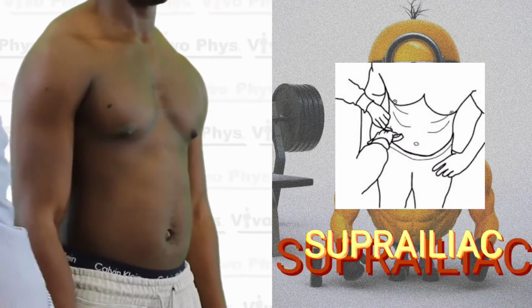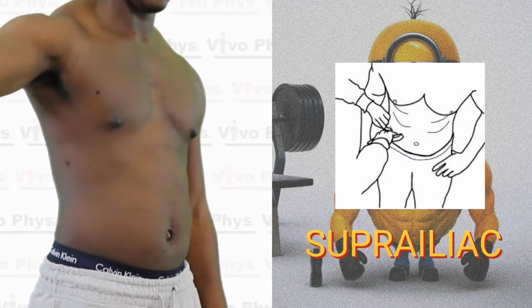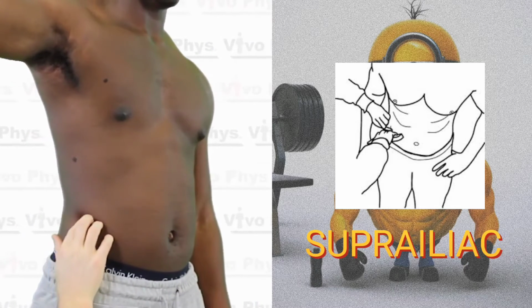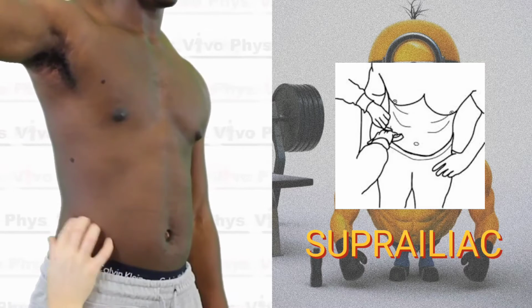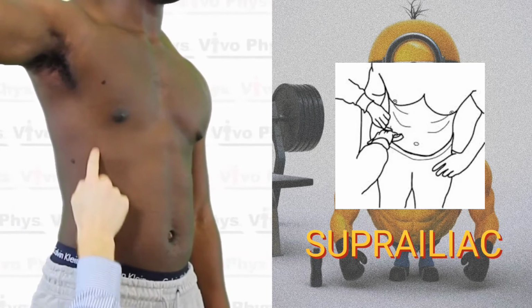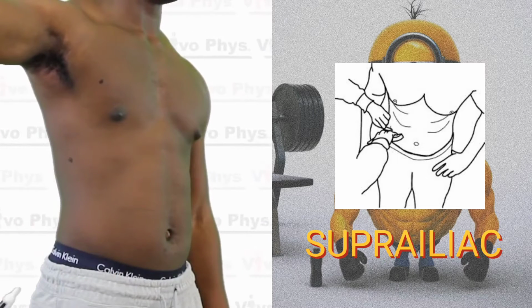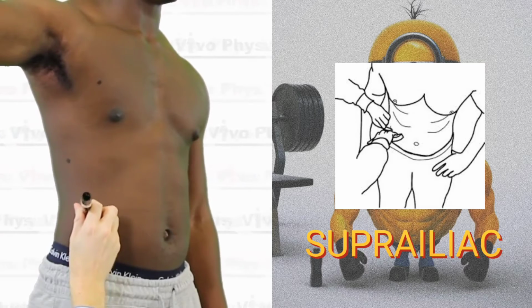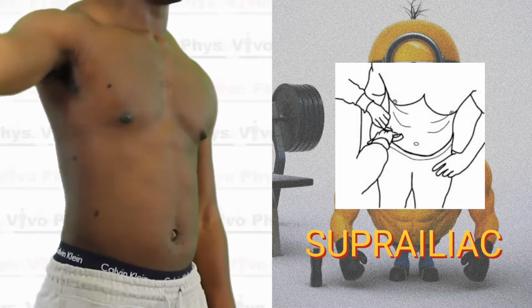The suprailiac skinfold site is going to be on the right hip of the individual. So what you need to do is palpate and try to find the iliac crest. Sometimes this is difficult and you have to sort of estimate where it should be, but once you can palpate and trace that, you're going to look for where the front of the armpit is and go directly down from that. So it's going to be almost on the side of the individual.